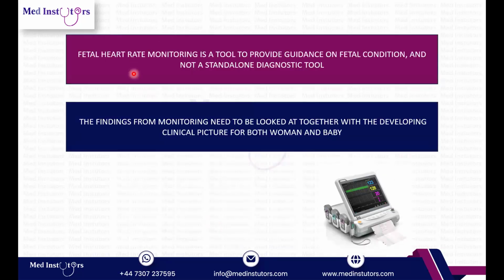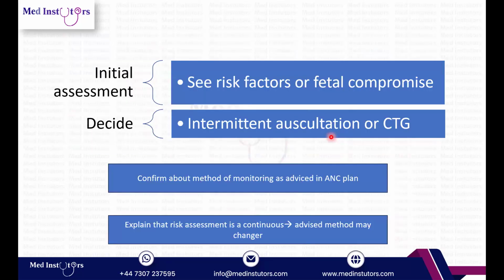So that is what it's saying. Fetal heart rate monitoring is a tool to provide guidance on fetal condition and not a standalone diagnostic tool. The findings from the monitoring need to be looked at together with the developing clinical picture for both the woman and the baby. So this is something which is very important for our practice, because we just can't look at a CTG without knowing the history of the patient. So even questions would be asked in such a way in the exam wherein they will obviously give you some clinical stem and history of that particular woman.